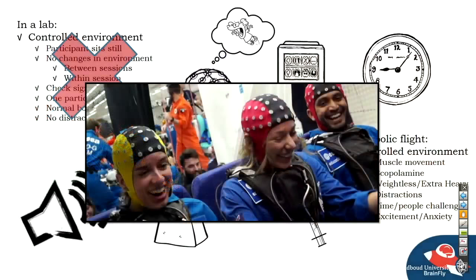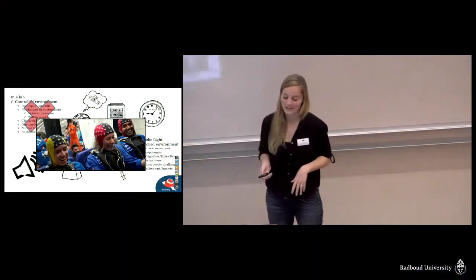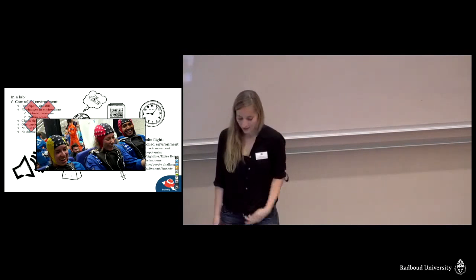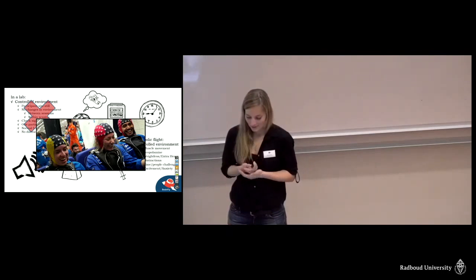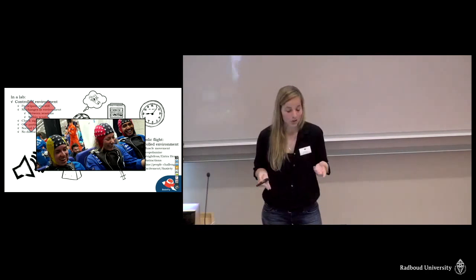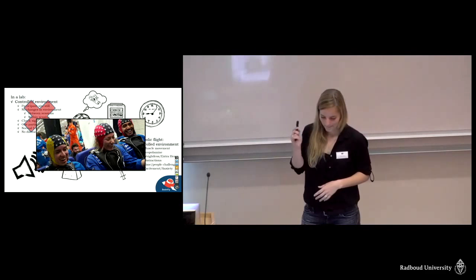So this is what the first parabola looked like. We instructed our participants to sit still, but in this case, we couldn't really do that with the first parabola. So they were just task-free to just experience it. And this is, I think, the phase that everyone has at the first parabola. So we didn't use this parabola in the analysis, just a side note. The rest of the parabolas were actually focused. Our participants did really well. They could remain focused to the screen, which also helped against the motion sickness. So that was a good aspect.